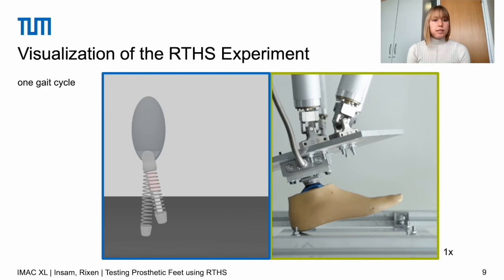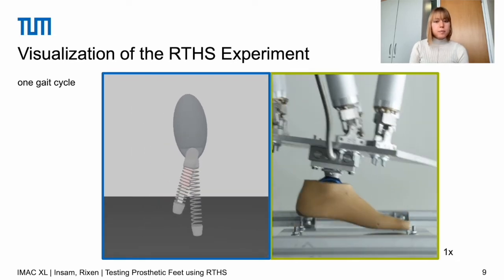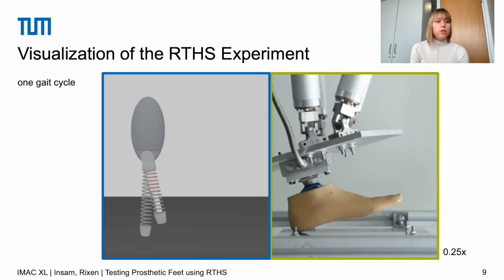Here I want to show the results of a test. We performed one gait cycle where the model starts on the left leg, and then it performs one stride, meaning that the right foot will overtake the body weight, the left leg swings forward, touches down, and the gait cycle stops when the model is in the same position as it is here. Let's see the results. First in real time. And as this might have been a bit quick, I have a slowed down version as well.